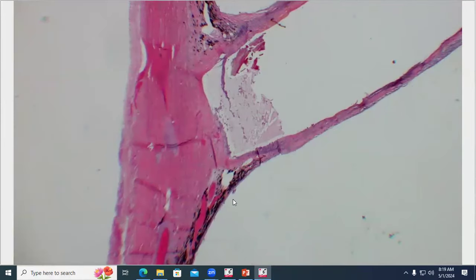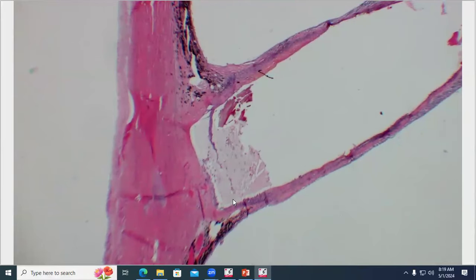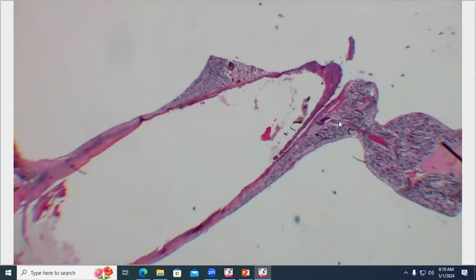And then this is posterior sclera. That's as far back as we can go. This is posterior sclera right where the porcupine quill went in. So we have choroid on one side, choroid on the other. The sort of regular dense collagen fibers of the sclera are disrupted by a more disorganized fibrous tissue in the middle. And then we have this sharply demarcated space where the quill had passed through. Just in general. And again, through the retina.